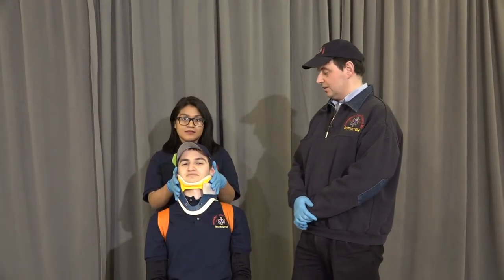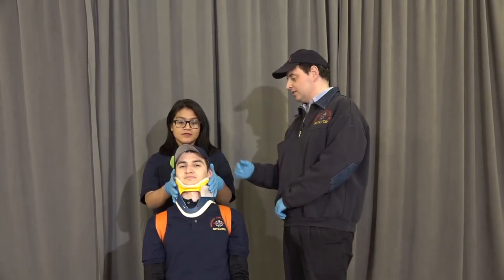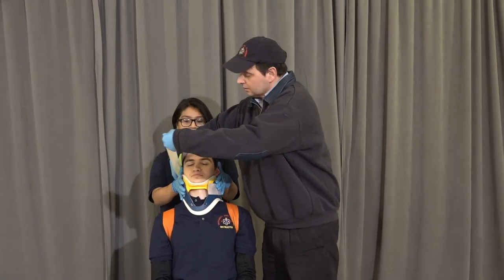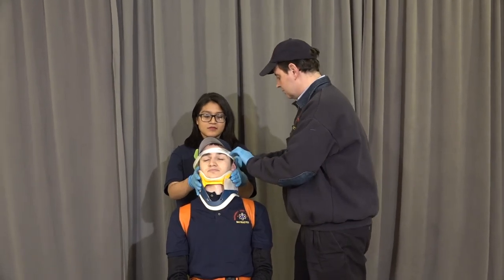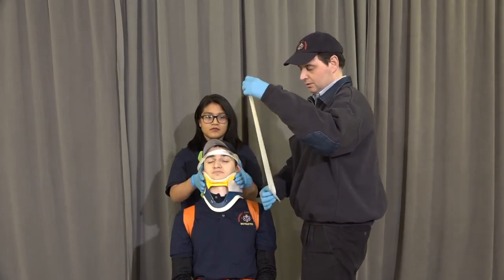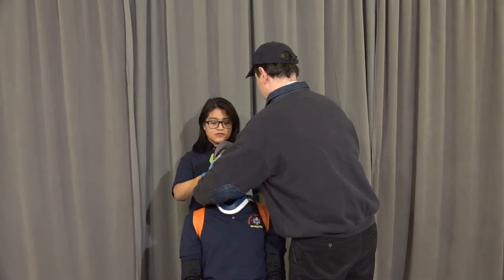Once we've secured his body to the shortboard, we have to secure the head to the shortboard. We're going to evaluate behind to see if there's any space that needs to be padded — in this case there isn't. We're going to take some tape, come right across the forehead, and then take another piece of tape right across the chin and secure that in place as well.